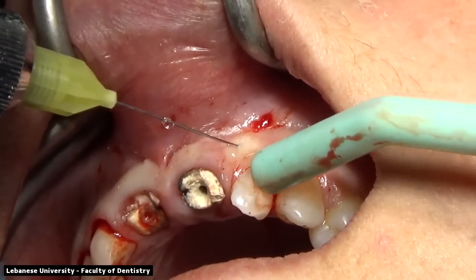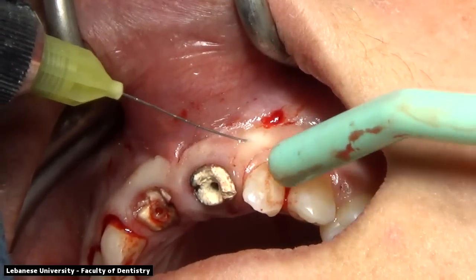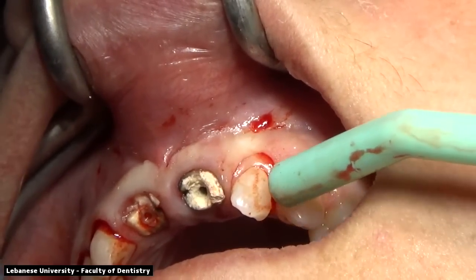So we have some bleeding. What we're doing is we're placing some anesthesia points to do some vasoconstriction and decrease the bleeding at the site.